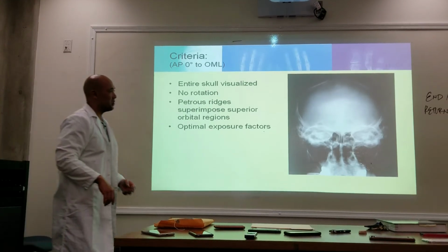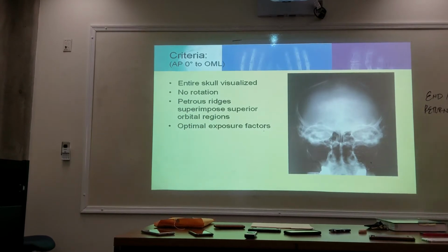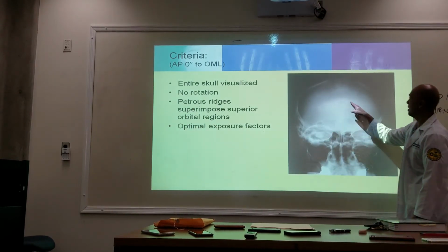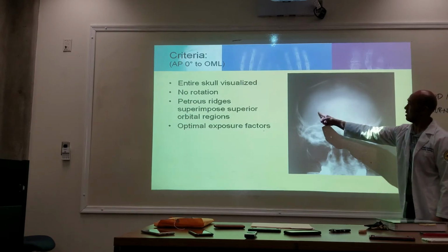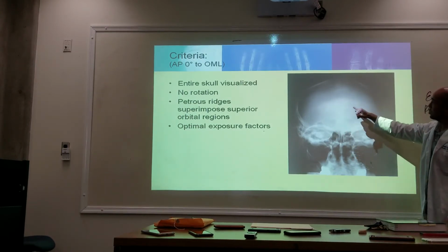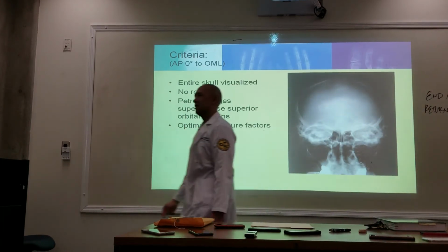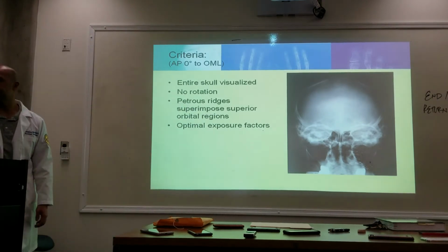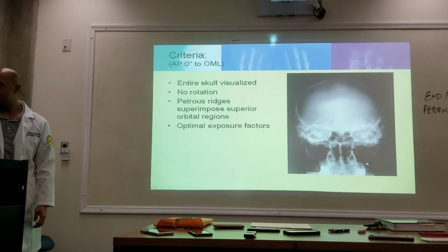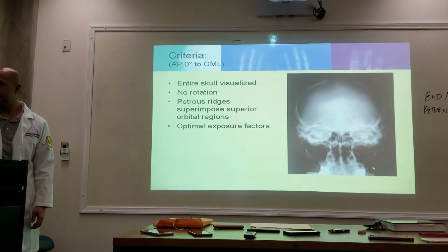Now, using your x-ray eyes, can you see the lambdoidal suture of the occipital bone? You see it? Okay. So this line here is the lambdoidal suture in the back, and you have your sagittal down the middle. What's going on over here? Staples of something, right? Back of the head, most likely.